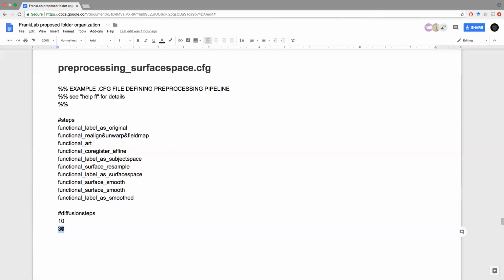So that means that you typically have 6 neighbors for every node, and for each individual step, you look at the average across all of those 6 neighbors, and you compute a weighted average of the value that you have for yourself and the value across your 6 neighbors. And then you do that 40 times overall to do the entire level of smoothing. Does that make sense?